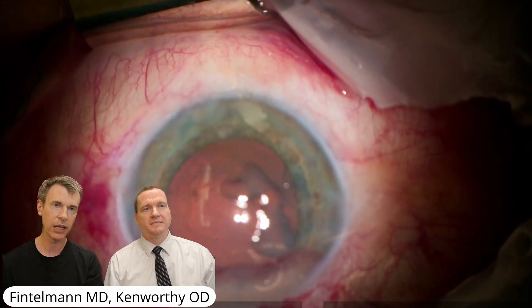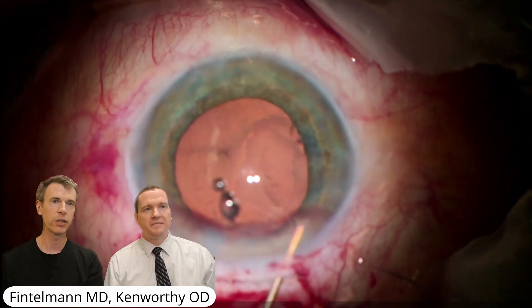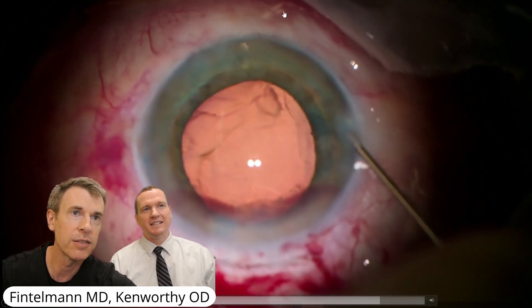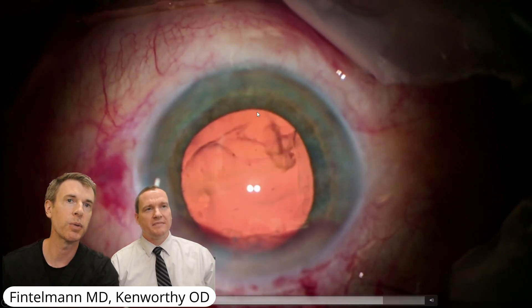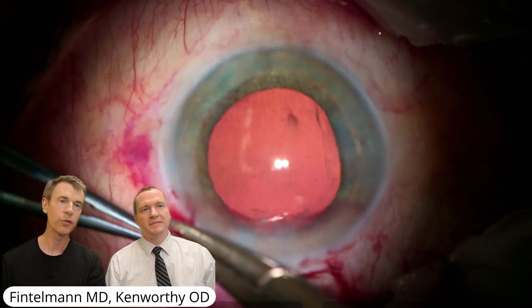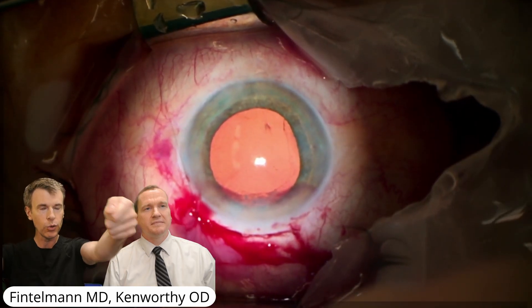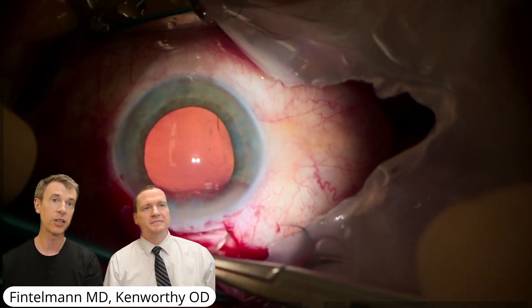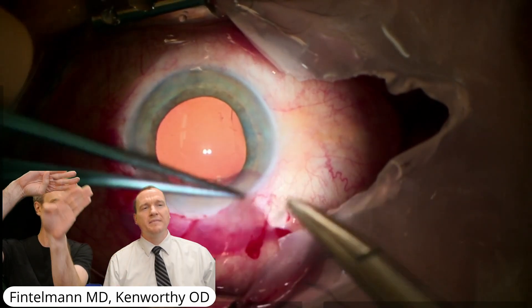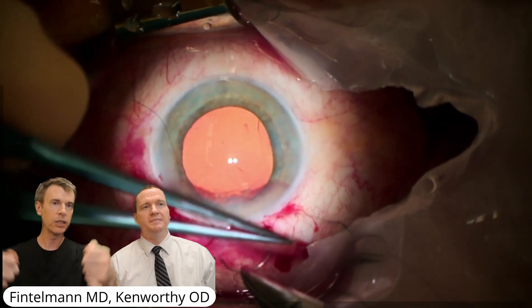I clean up the rest and at the end you can see the very big difference. This little white stuff injected is Kenalog. Any vitreous would show up — we call it throwing a sheet over a ghost — it would show up. Here's some more viscoelastic left behind. I irrigate it out to decrease the chance of a pressure spike. Wounds are hydrated. This wound, even though it's large, is self-sealing. The only sutures are placed in the conjunctiva to seal it over the opening in the sclera. That wound starts in the white part, gets tunneled into the cornea, and then the conjunctiva is covered over it — and that seals.